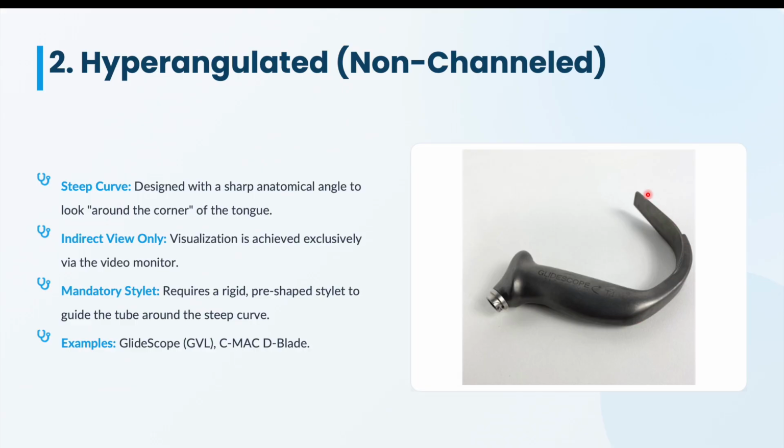The path is not straight, so you will need a special curvature in your endotracheal tube if you want to intubate using these scopes. For this we need to put a stylet inside. Plus another problem is the learning curve for using these scopes is rather steep and you need practice if you want to intubate with these scopes.